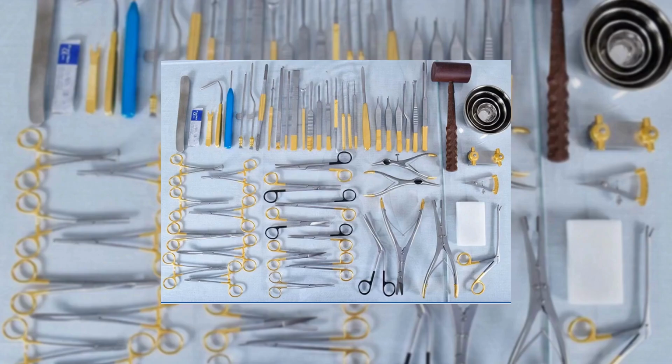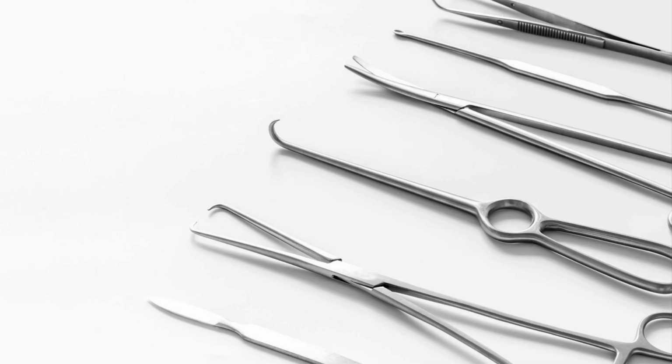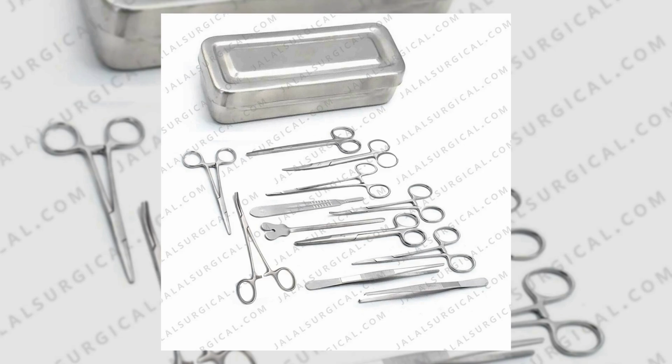2. Categories of surgical instruments. Cutting and dissecting instruments. Examples: scalpel. Describe as a small, sharp knife used for making incisions. Scissors, used for cutting tissues or sutures, often with different types for specific purposes, e.g. Mayo scissors for tougher tissues.